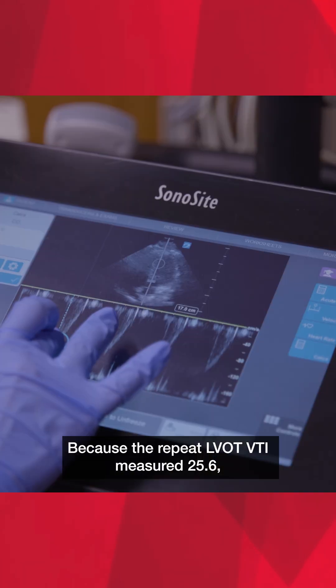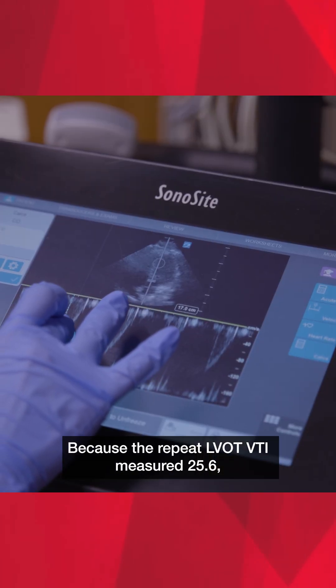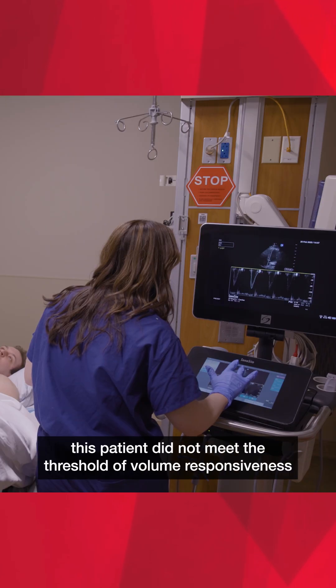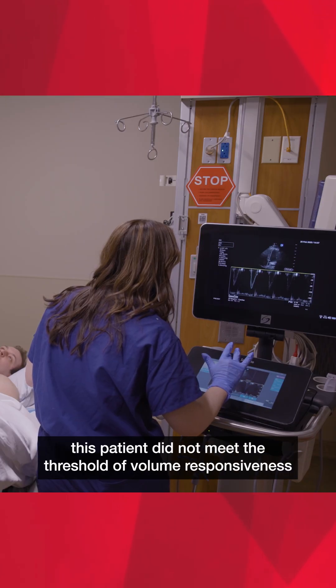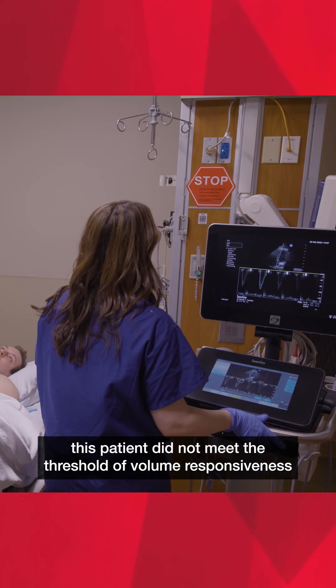Because the repeat LVOT-VTI measured 25.6, this patient did not meet the threshold of volume responsiveness, so a fluid bolus would not be recommended.